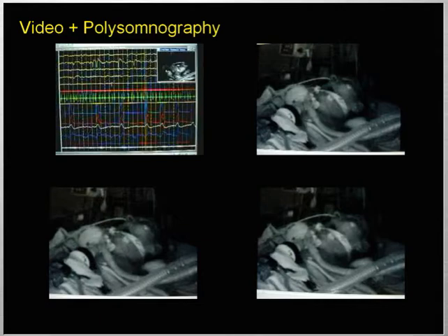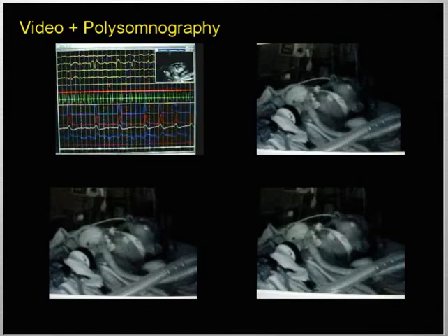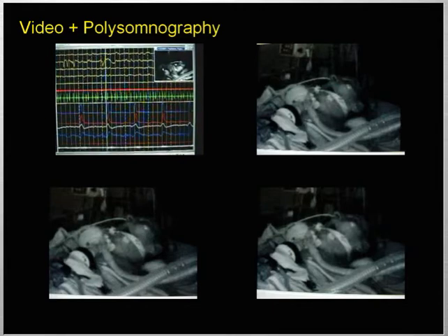So not only is muscle injury a factor in the impact of patient-ventilator interaction, but here are studies that are being performed at our laboratory, where we're doing polysomnograms in these ICU patients, critically ill patients. And this is a polysomnogram, and during that period of time, we are capturing video at the same time. And here, top to bottom, are all the tracings in a polysomnogram, starting from EEGs to electrooculograms to electromyograms, electrocardiograms, and flow and such.